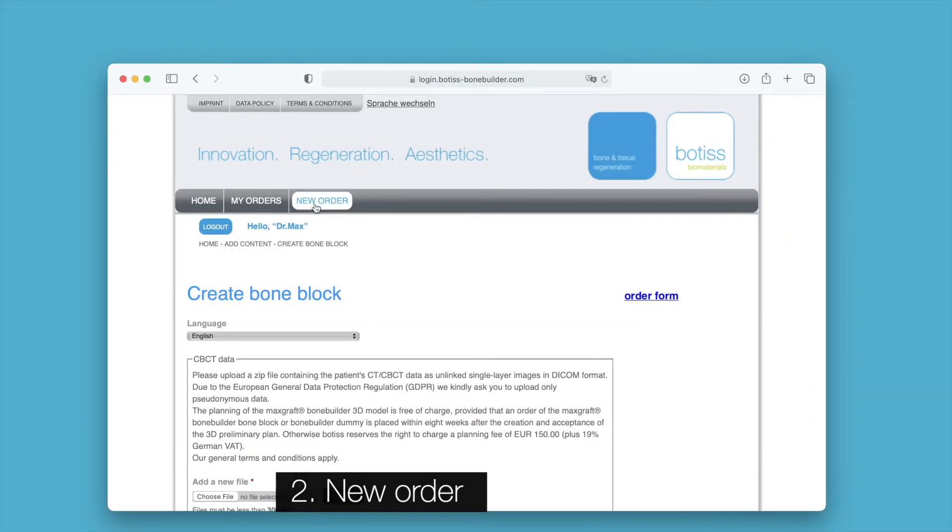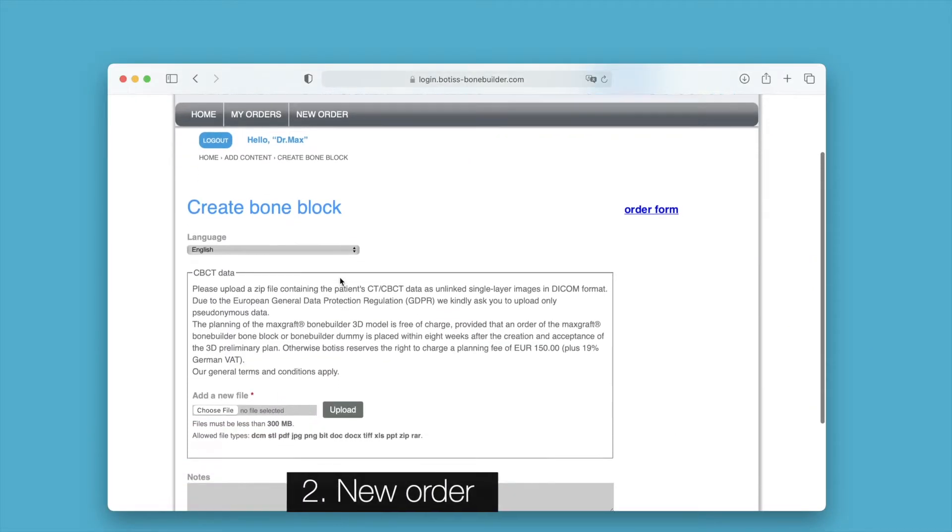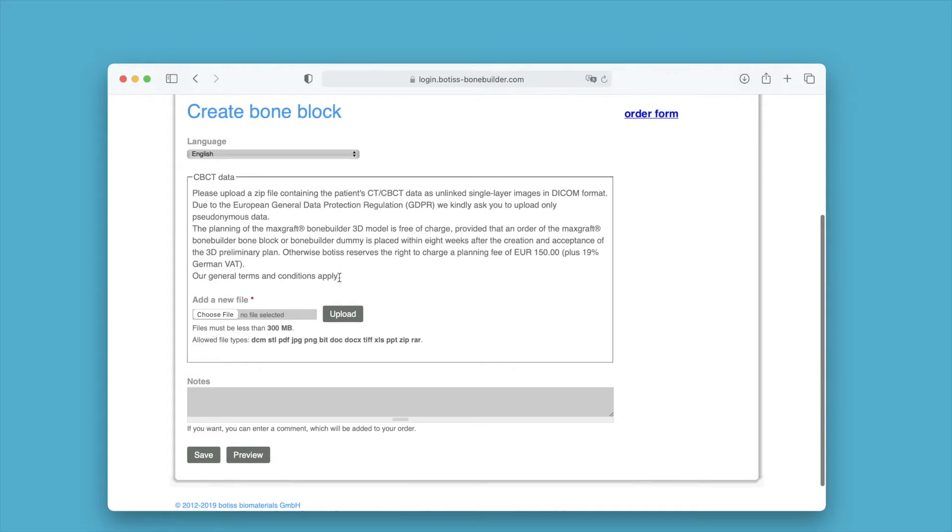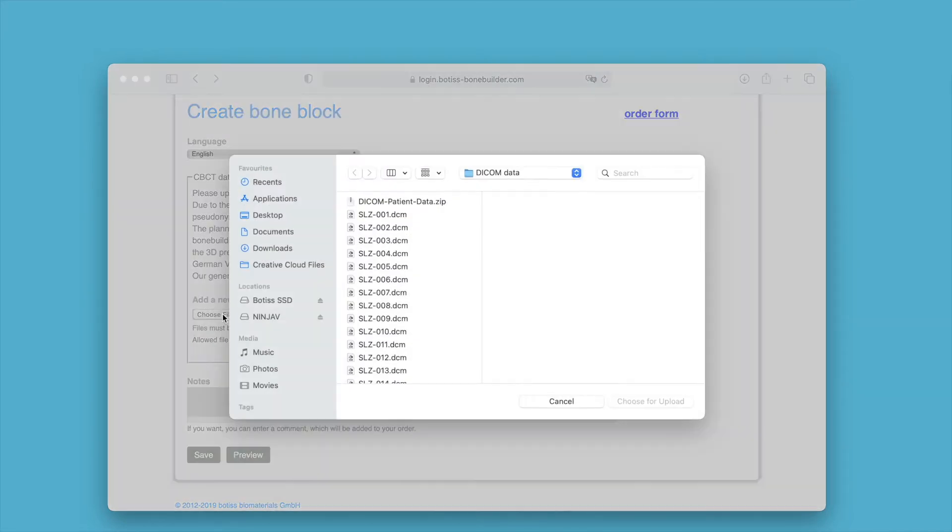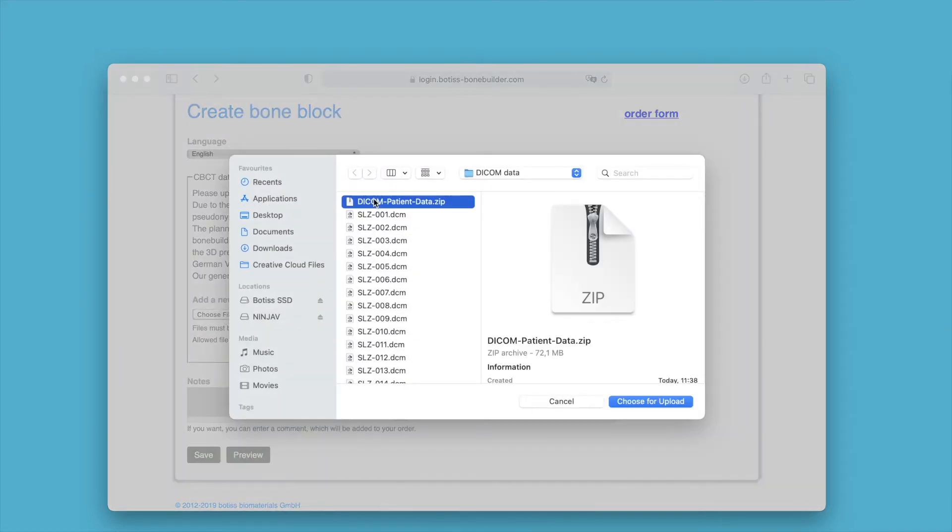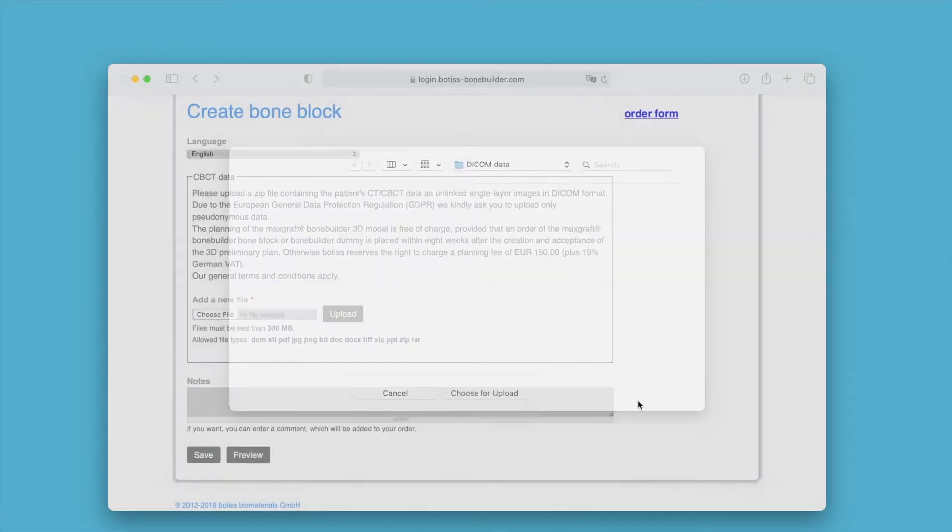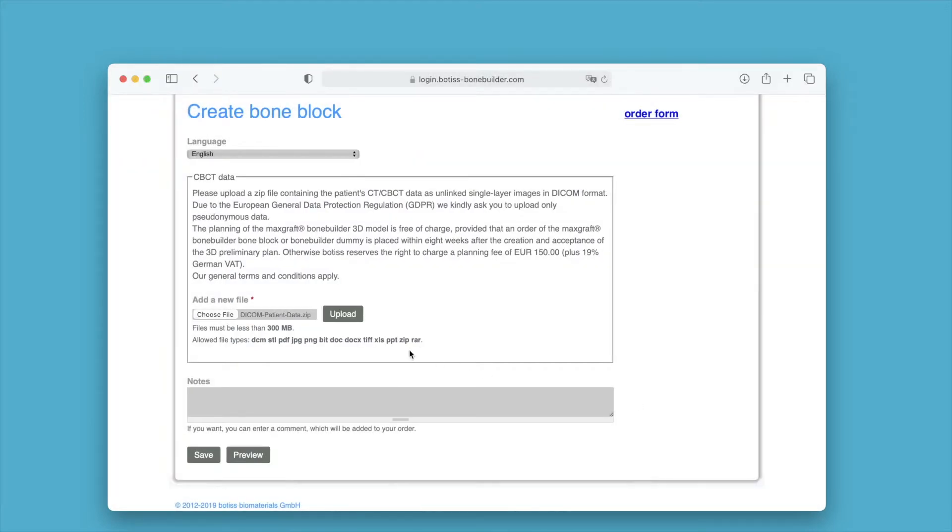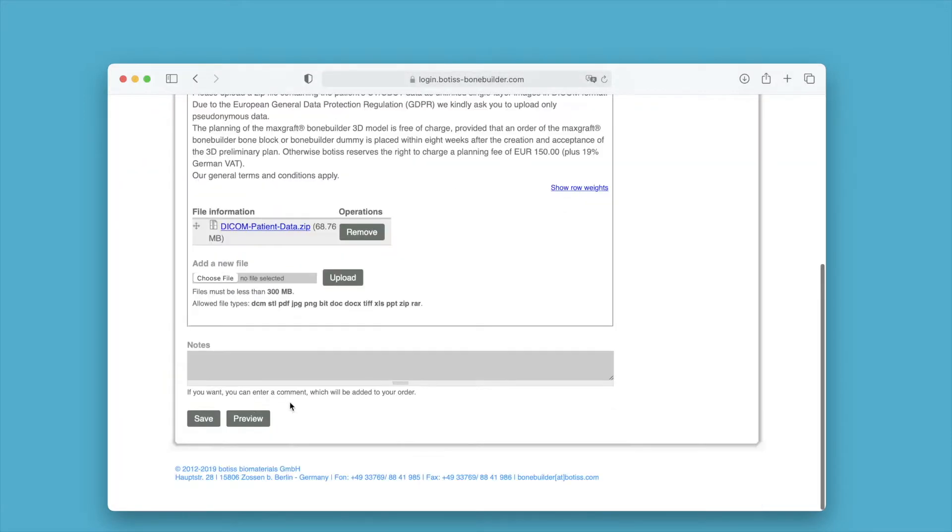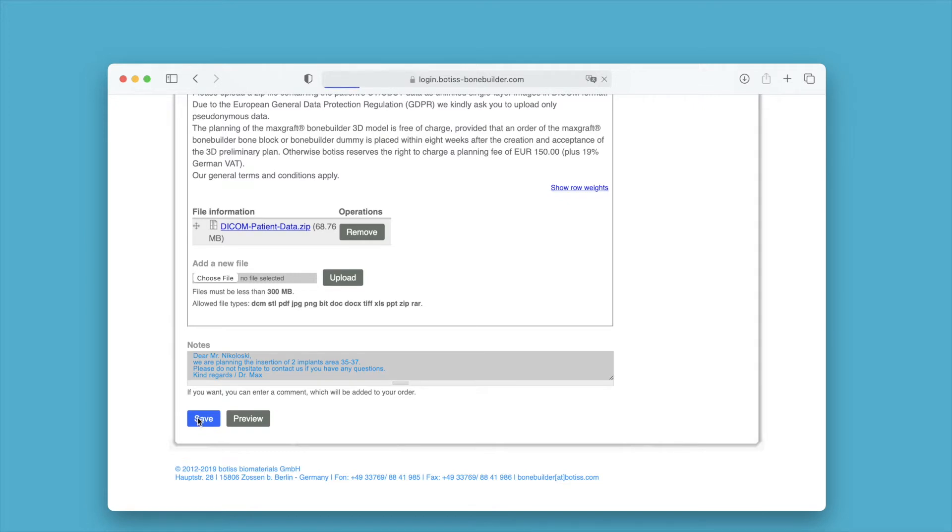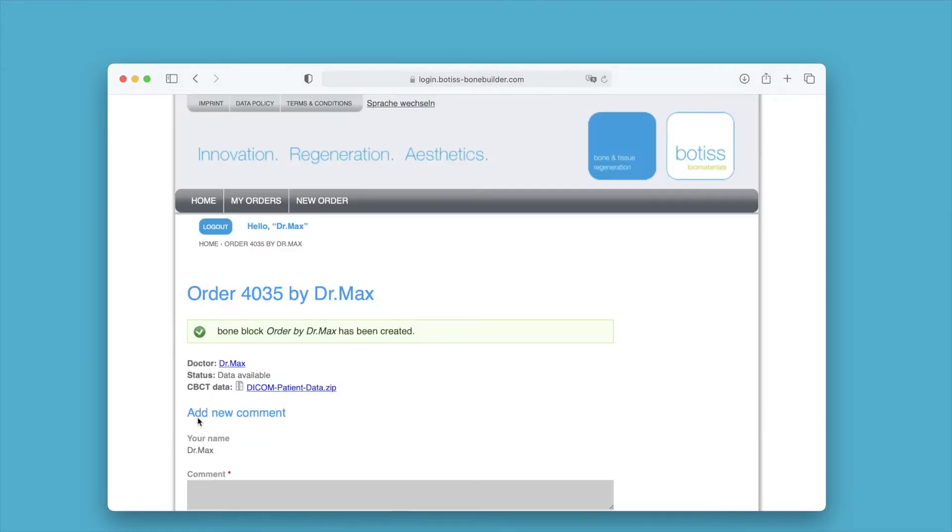Click on the button new order and select the zip file with the patient data in the upload section. Then click on upload. You can enter further comments or notes regarding your order in the notes section. Then click on save.